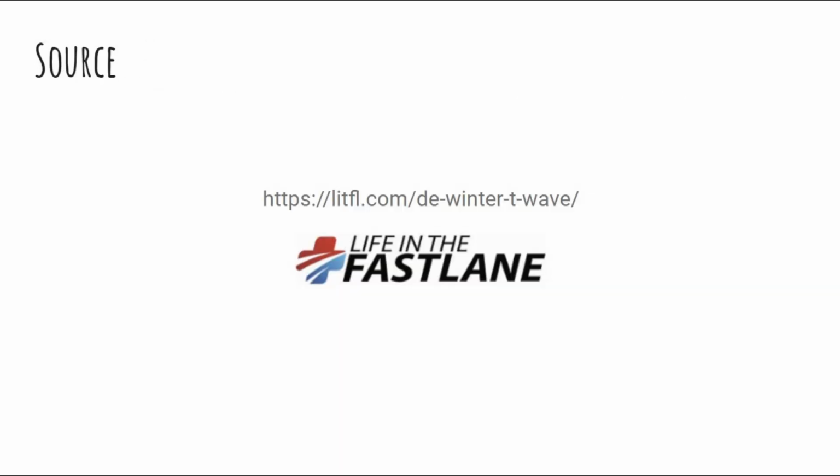In summary, the De Winter T-wave is an essential but often under-recognized ECG pattern signaling acute myocardial infarction. Recognizing it promptly can make the difference between timely reperfusion therapy and devastating outcomes for patients.